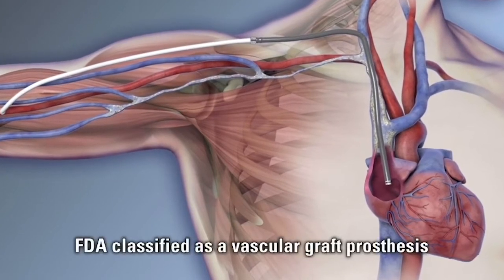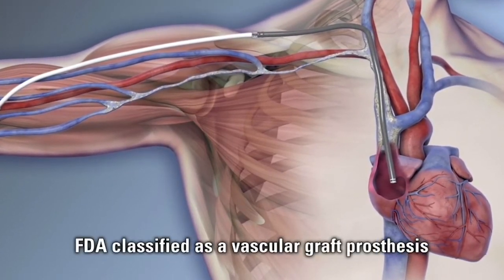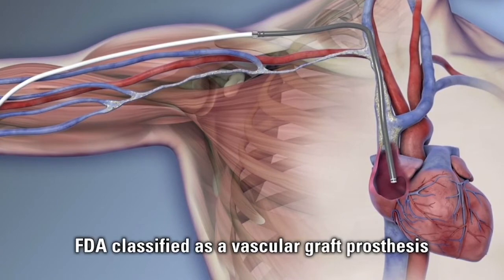HeroGraft is FDA-classified as a graft. However, unlike a conventional graft, there is no venous anastomosis.